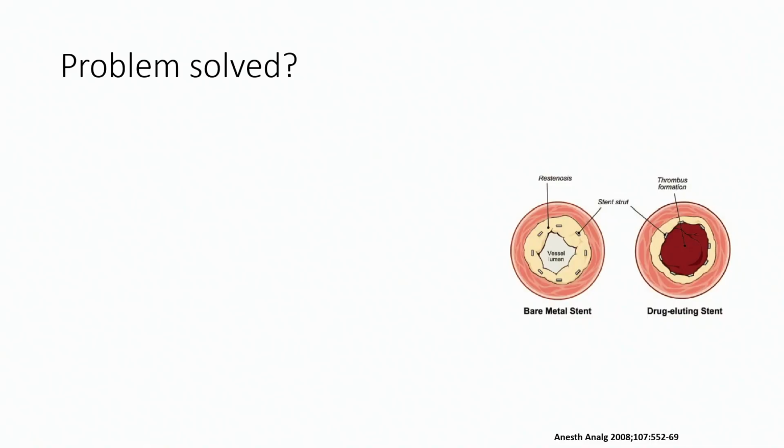And the vascular endothelium gets disrupted with just the mechanical effect of the placement of the stent. And the endothelium is also the non-adhesive protective layer that's coating the vessels, that's preventing the circulating platelets from coming in contact with the subendothelial collagen and connective tissue, which is highly, highly thrombogenic.